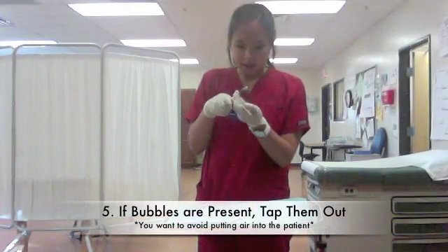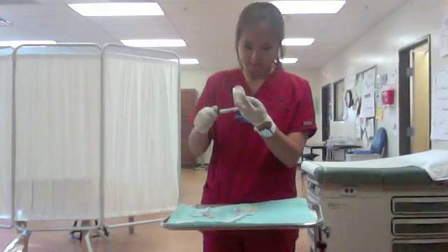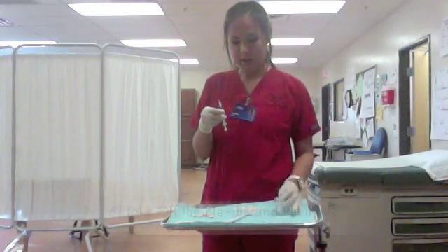Then you'll get your pen and start hitting it to get the bubbles out. And once that's out, you change your needle.